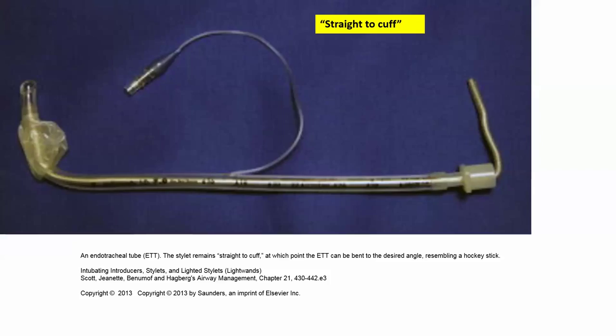It's made of aluminum and is coated with plastic. It may well be a little bit slicker than the wire that we use here at UK. Anything that you put into a plastic tube and which is bent at a 90-degree angle will be a bit sticky pulling out. So lubrication with a non-water-based lubricant might be a good idea if you want to be able to pull the tube out with ease, pull the introducer out with ease.